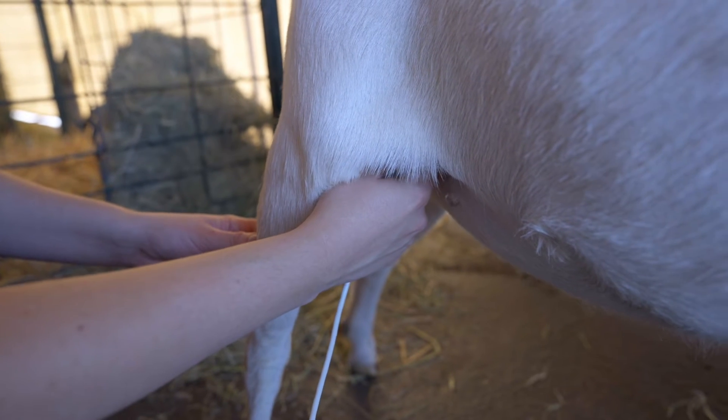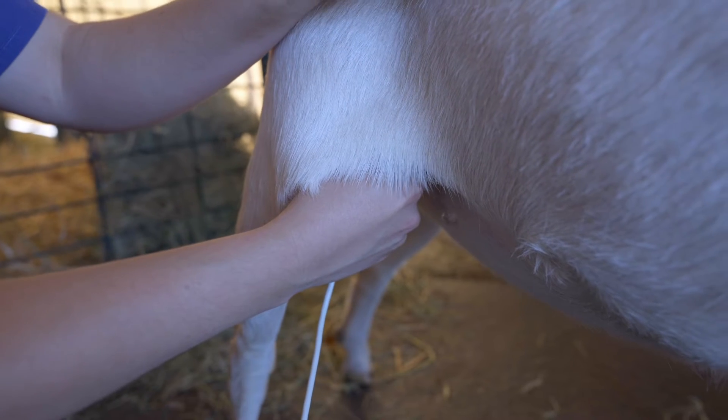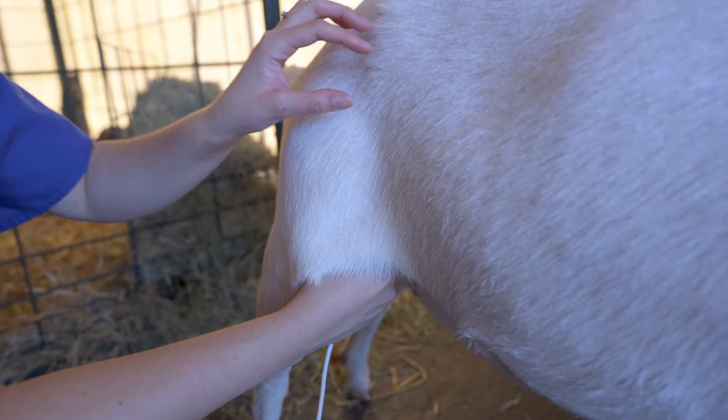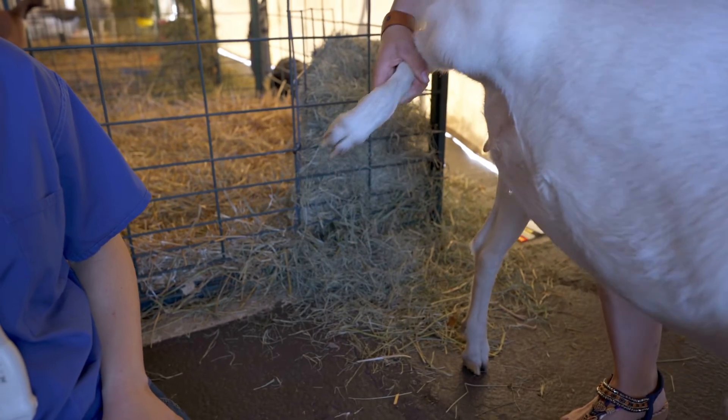I'll probably have to go quite high up underneath her leg and I'm looking for the uterus around about here. If you have somebody to help you, it's very useful if they can lift the back leg, folding it up so as not to put strain on the joint.